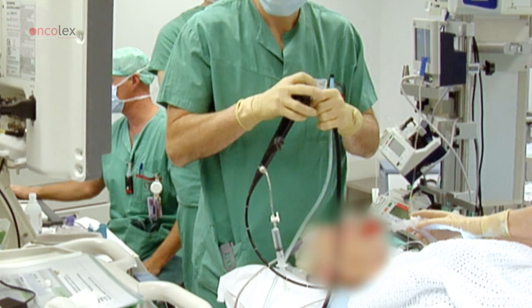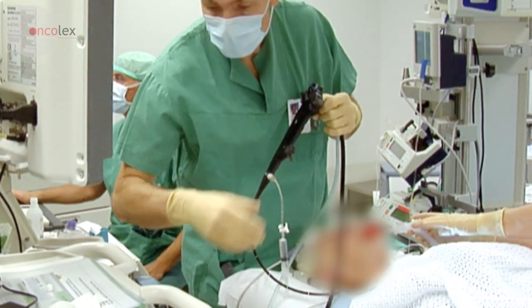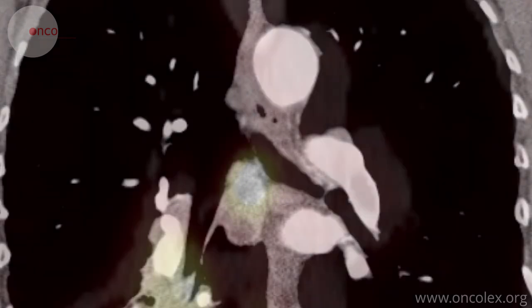This is a video of an endobronchial ultrasound-guided fine needle aspiration. The patient has a primary lung tumor. A lymph node in the mediastinum is to be examined for metastases. Both the tumor and lymph node show high uptake on the PET CT scan.